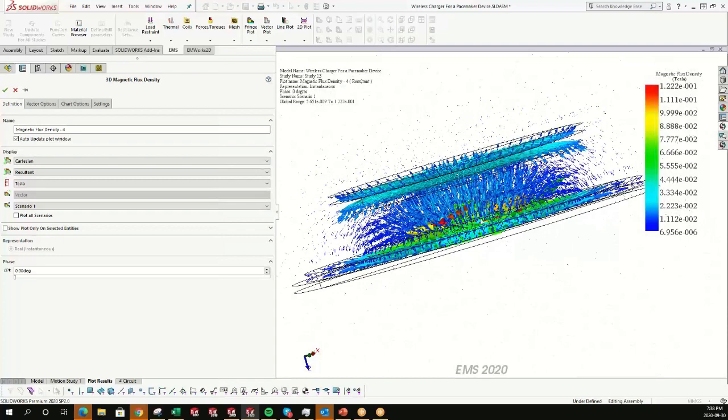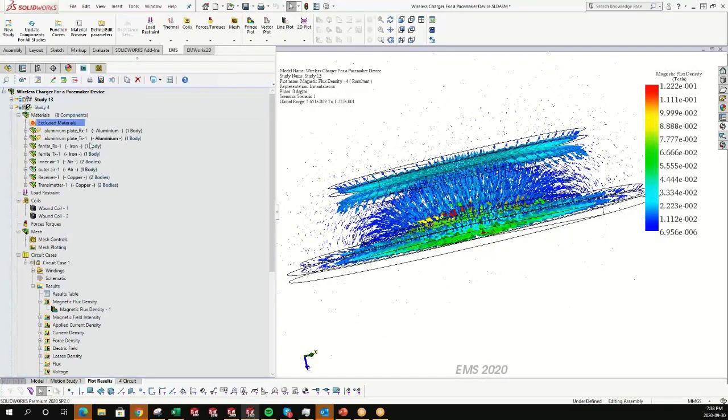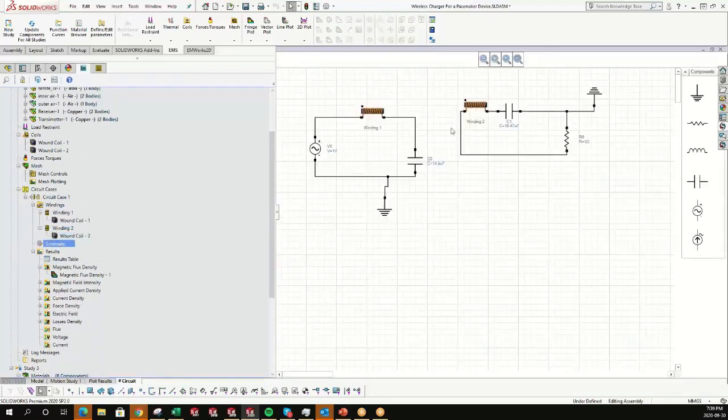Okay, we can see the vectors that go from the transmitter coil to the receiver. And this is so. Let's see now the circuit. This is our schematic.